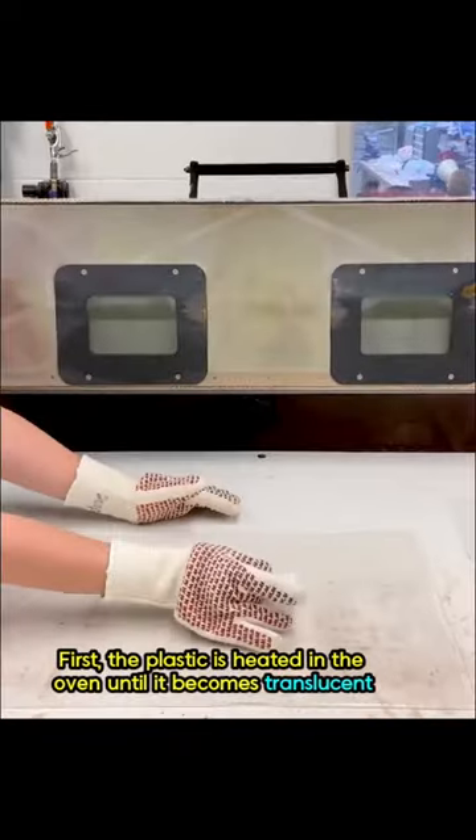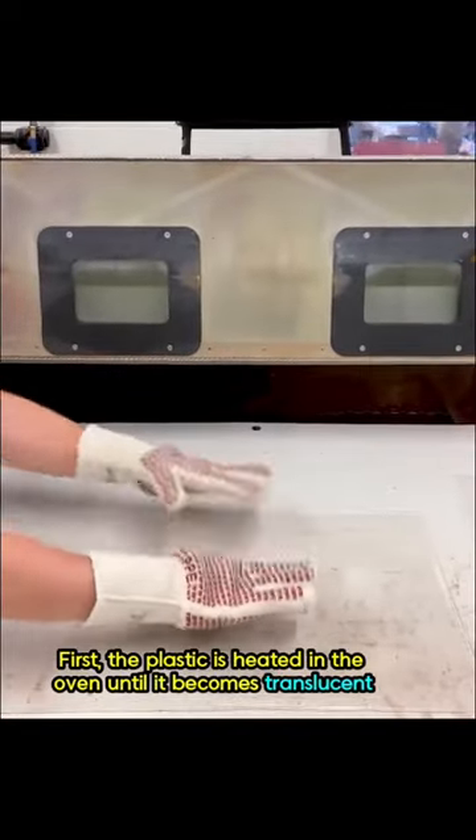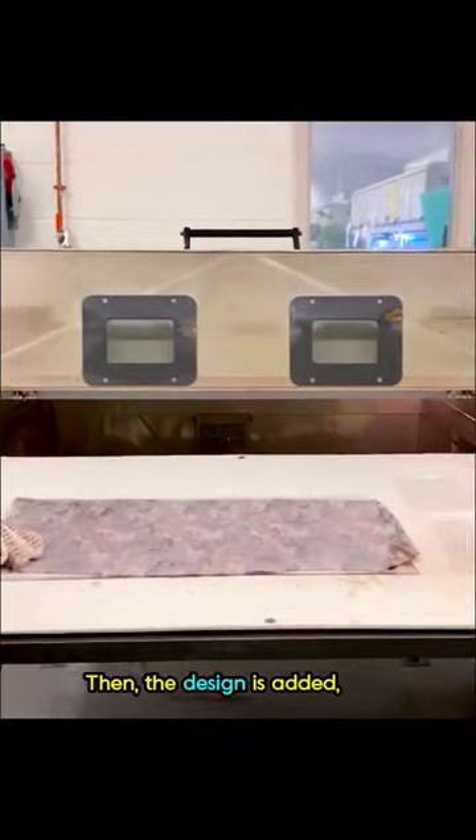First, the plastic is heated in the oven until it becomes translucent. Then, the design is added.